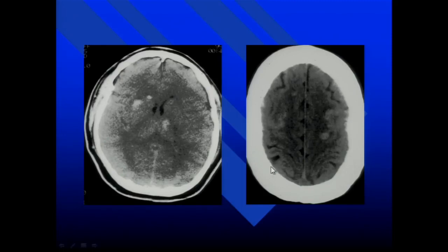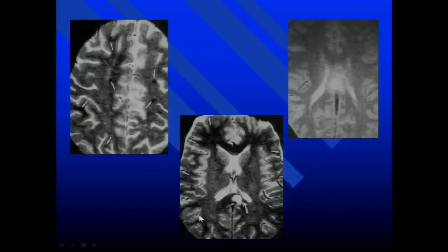Okay, and it's important to differentiate these from contusions because usually these patients don't do well at all. They usually do very badly when you have shear injury, diffuse axonal injury. Unlike the patients with cortical contusions, who could actually do pretty well, so it's important prognostic information.